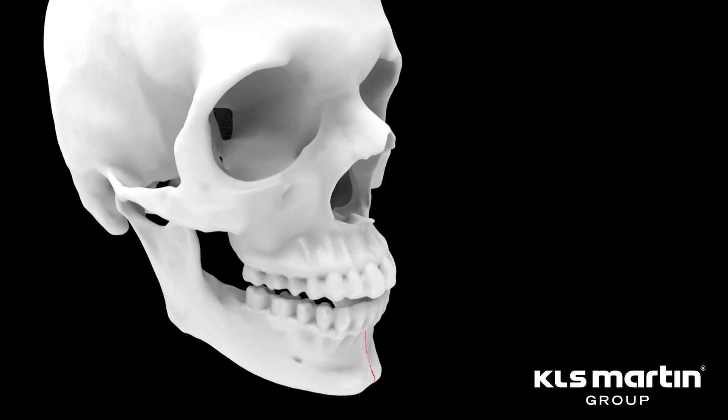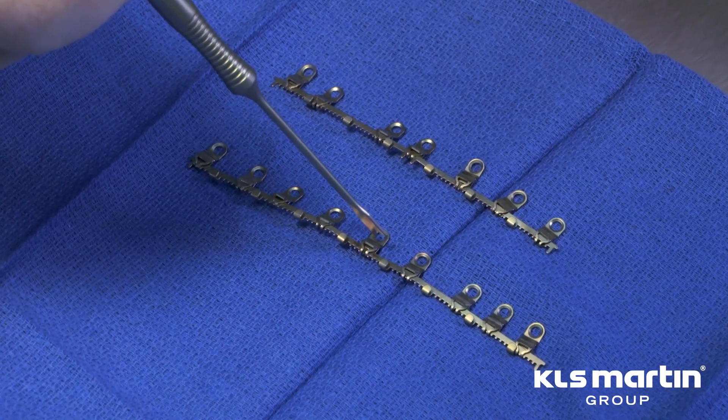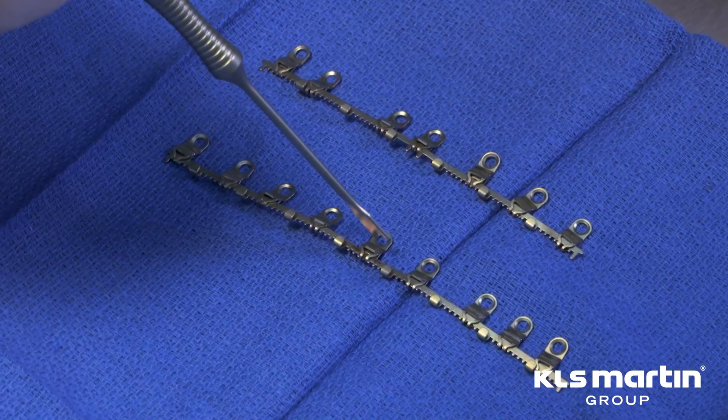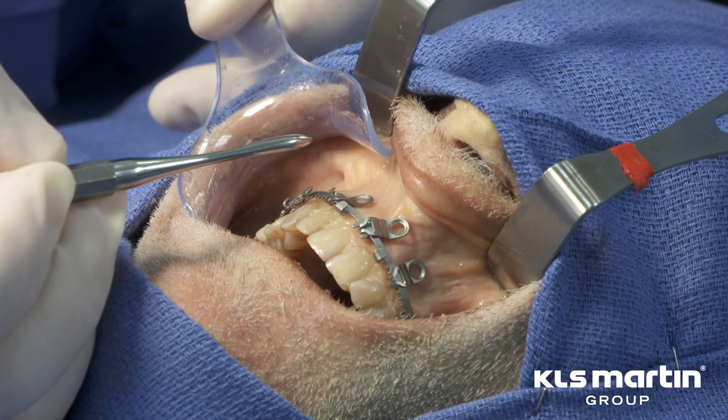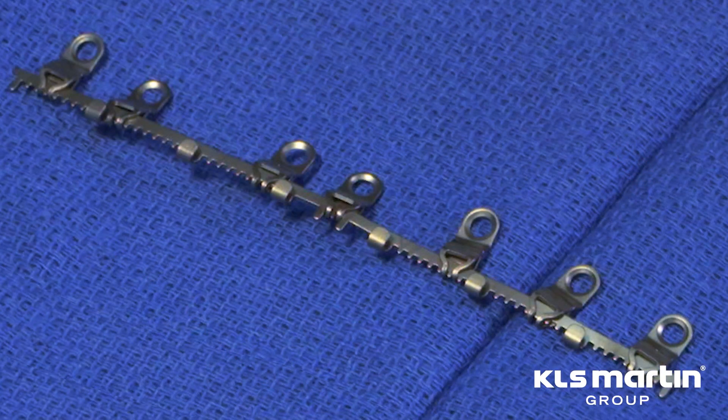If the patient has fractures in the midline, or there is a fracture that requires placement of the posterior portion first to ensure good connection to a minor fragment, the nine hole arch bar is selected. This nine hole arch bar has an adjustable midline sliding plate. In the patient in this video, there are no fractures in the midline or interrupting the arch of the maxilla, so we will select the seven hole fixed midline design.